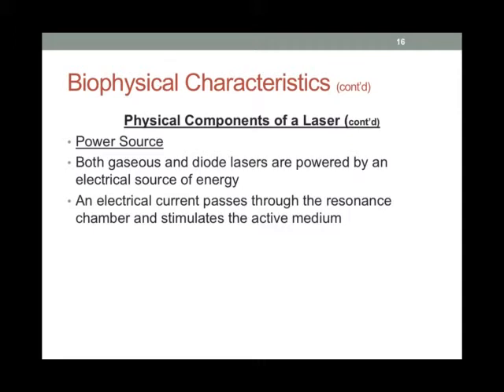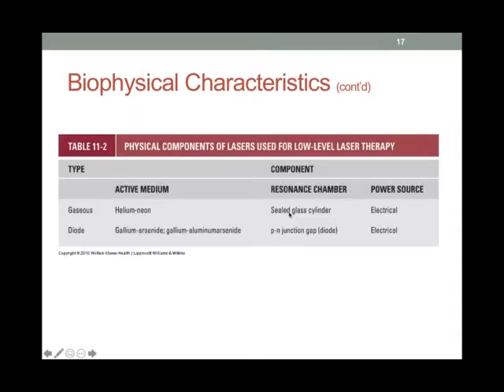Here again, it's an electrical source. This electrical source is being applied to either the gases in the glass sealed tube or the semiconductors in the diode lasers. So that electrical current passes through the resonance chamber and stimulates the active medium.